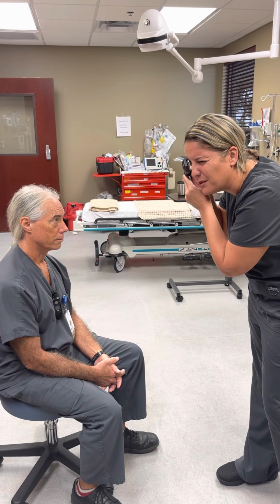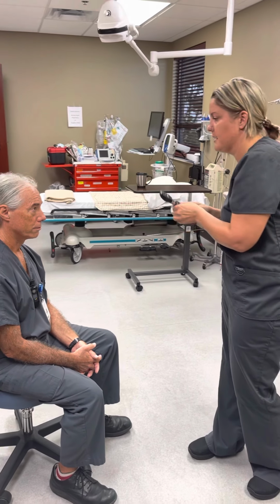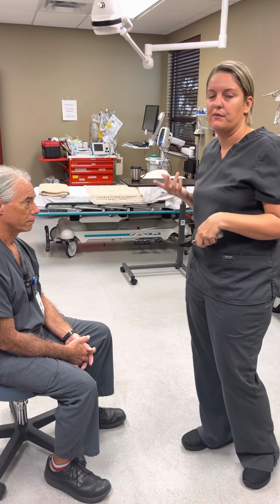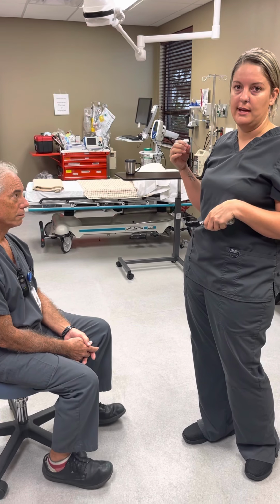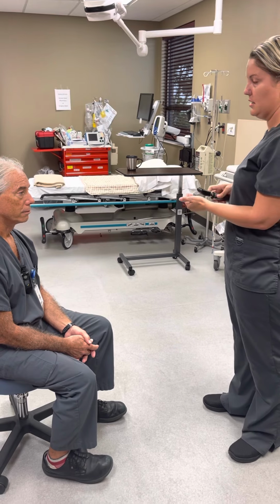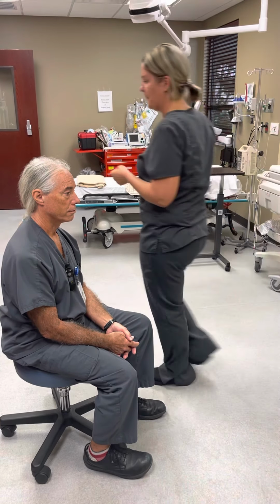And then you see the red reflex in the back of his eye, and then left. And then you're checking for opacities. It should be a red reflection. If it is cloudy, it could be like a cataract or a tumor or something. So that is it with the eyes, and then we'll do the ears.